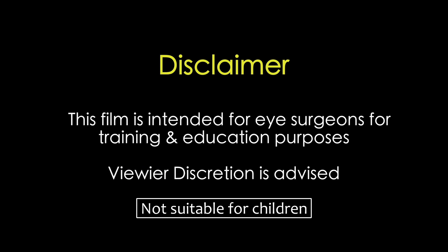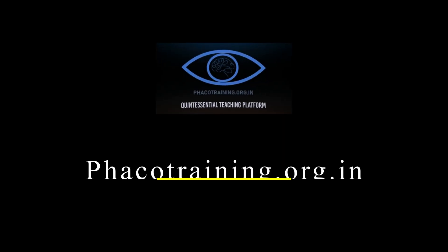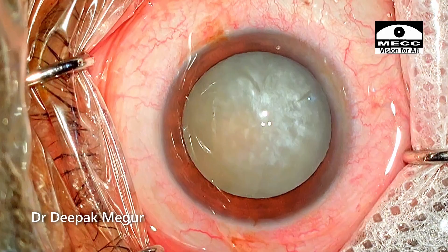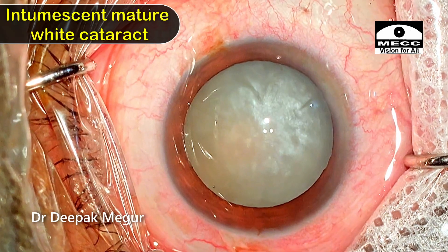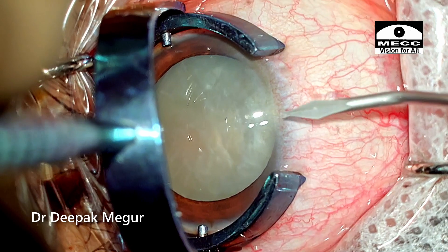This film is intended for eye surgeons for training and education purposes. Viewer discretion is strongly recommended. Welcome to yet another cataract vlog series where we look at this intumescent mature white cataract, and I'll be demonstrating a horizontal chop technique in this patient.